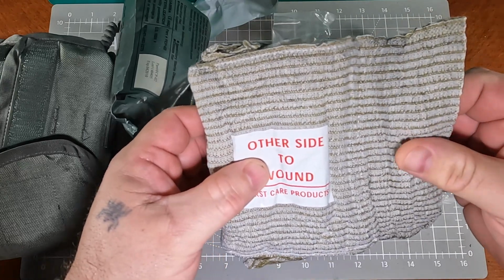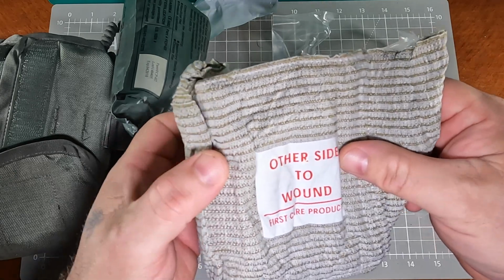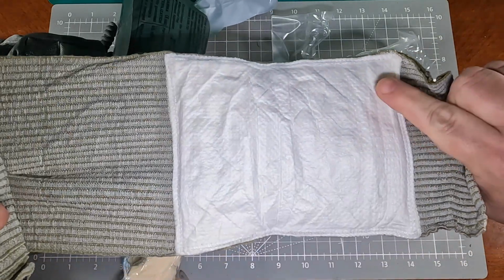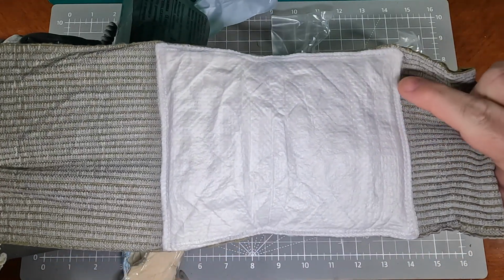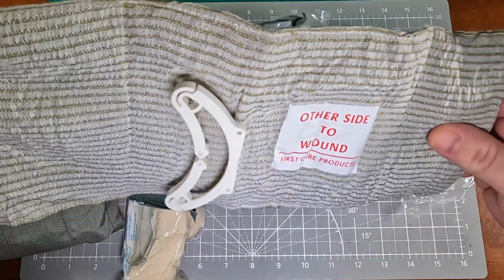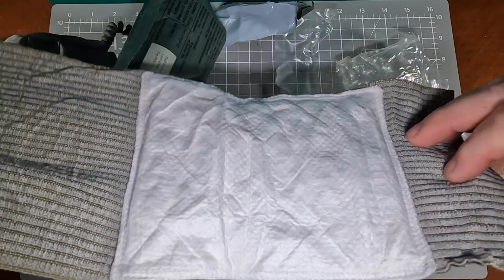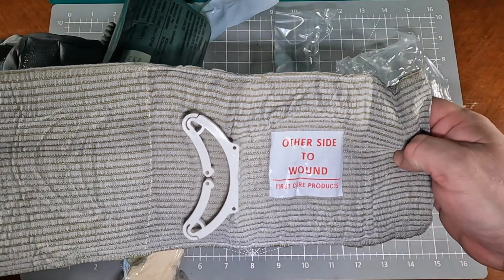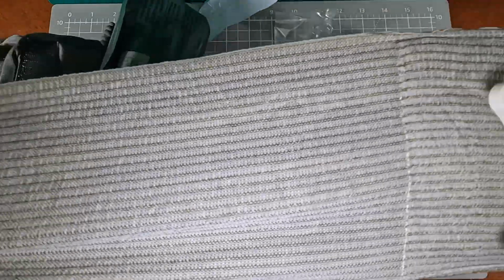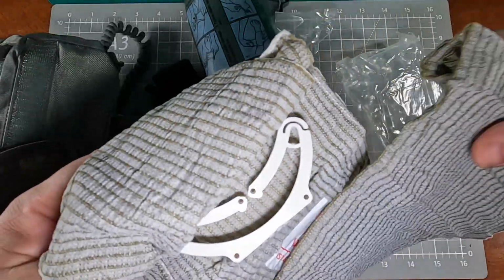It's designed to be used basically one-handed, so you can apply it to yourself if need be. But it comes out this side. Open it up similar to the other one, and then you basically put it on the wound. And here you have a little bit larger dressing, probably more like a 5x7 or 5x8, or 6-inch dressing, I guess, so it's going to be at least 6 inches by probably 8 or 9 inches. But you're going to apply it down onto where the wound is, and it's made out of like a bungee strap. It's kind of flexible, and then you'll just basically start going around and wrapping your wound as you need to.